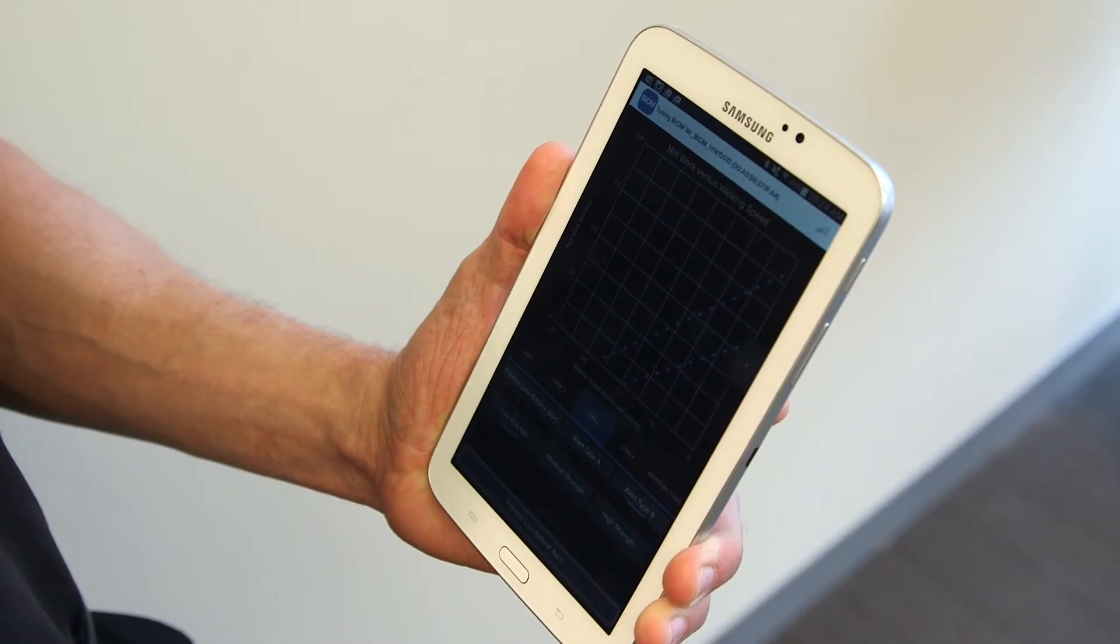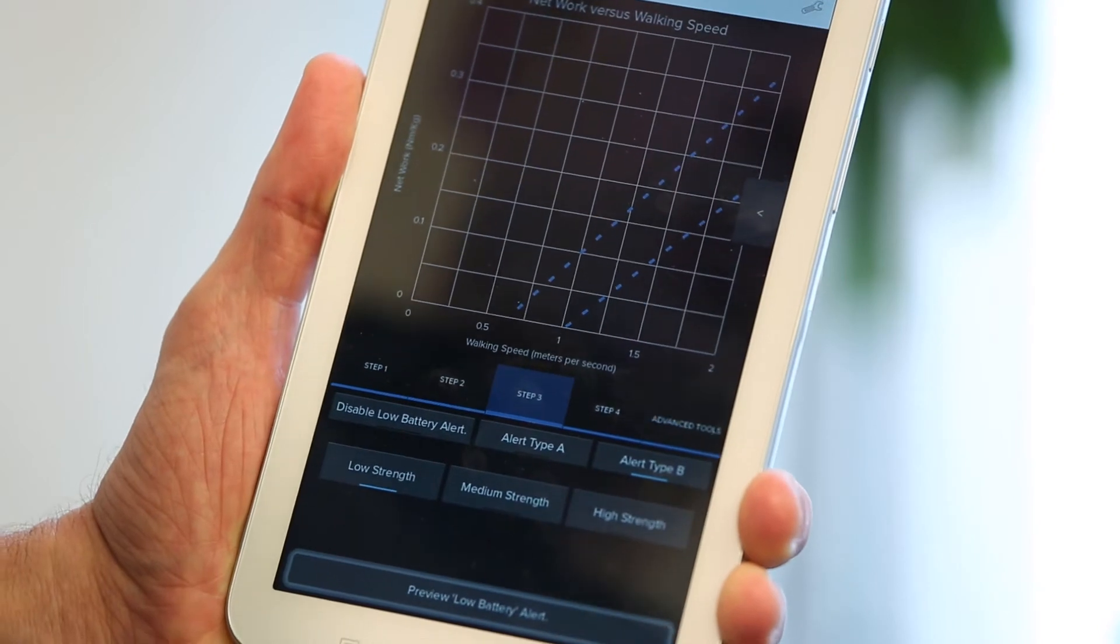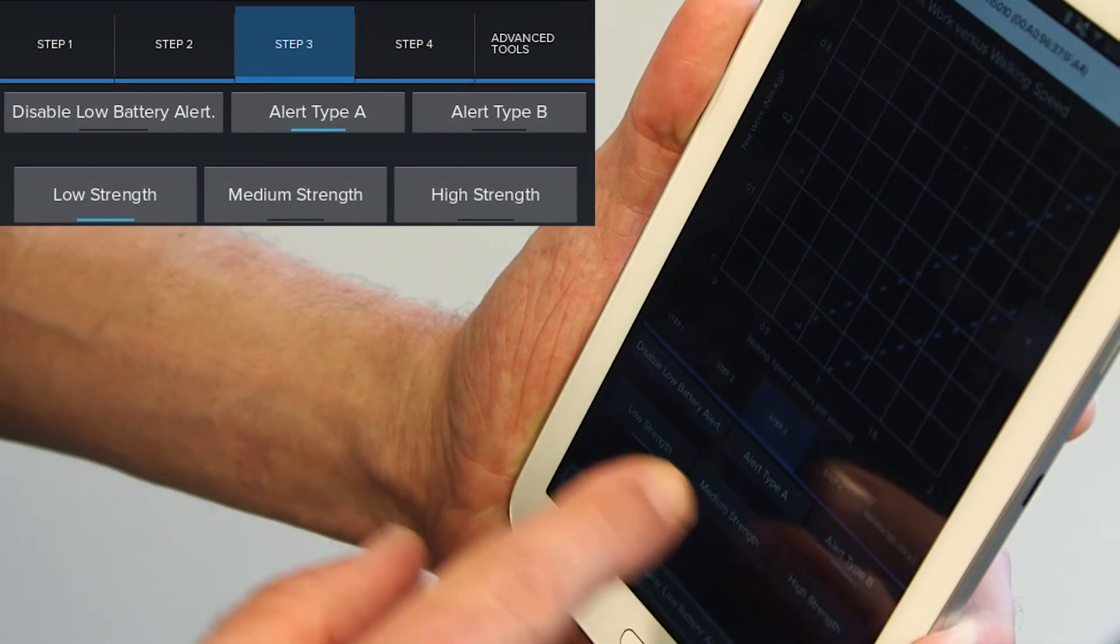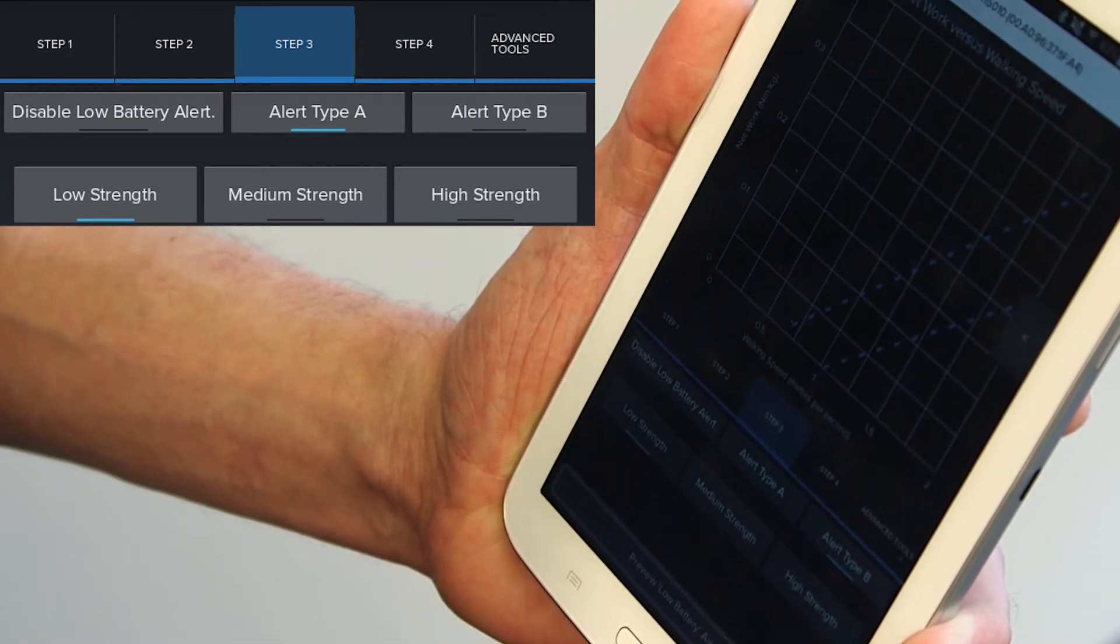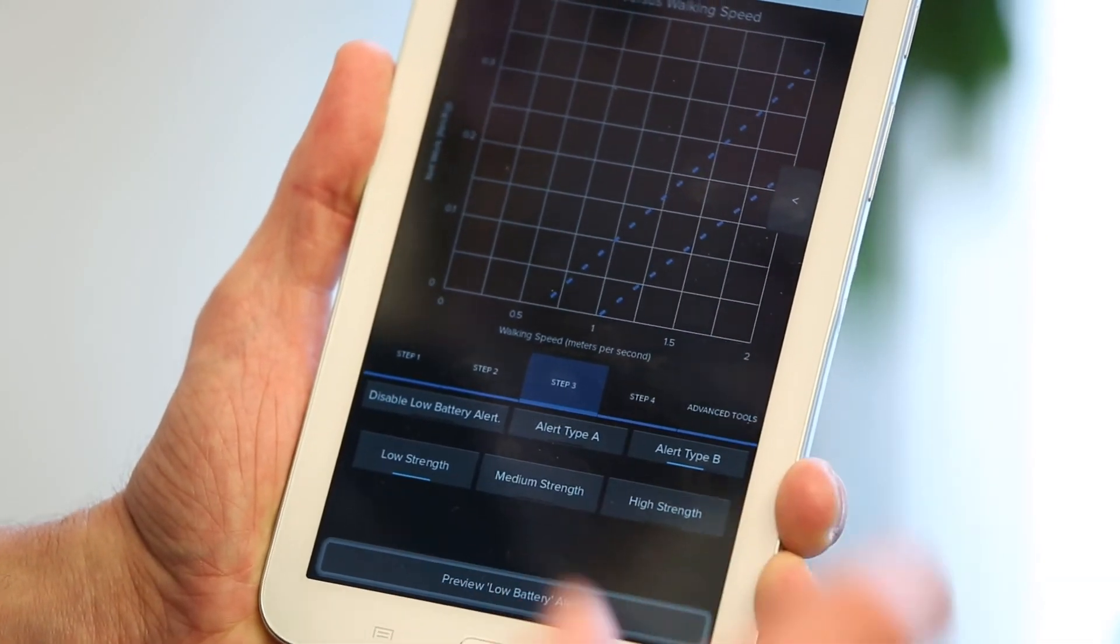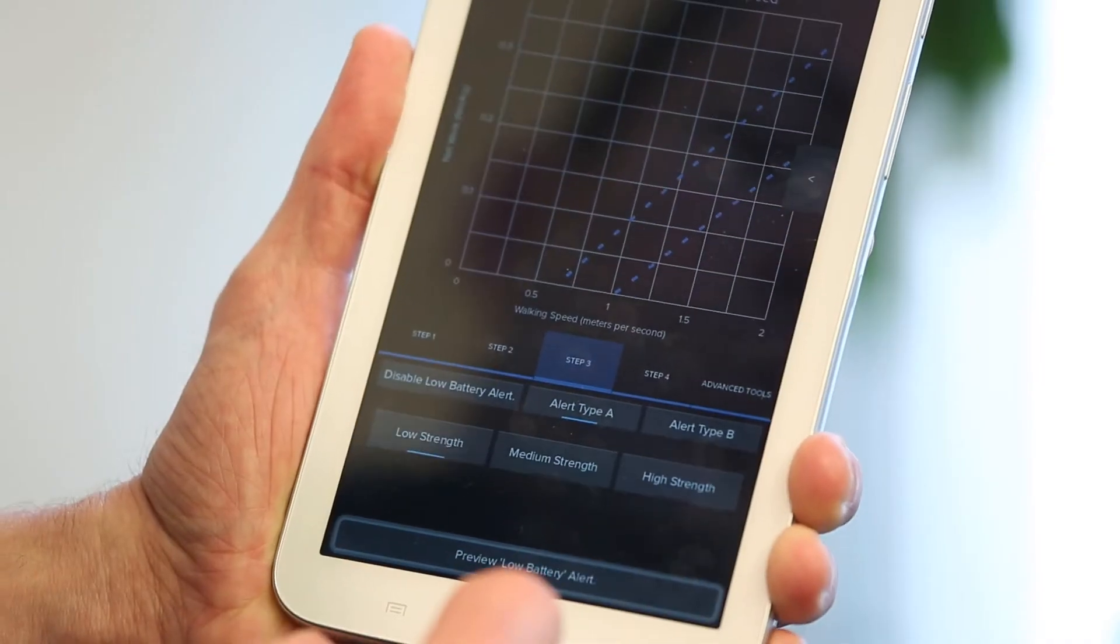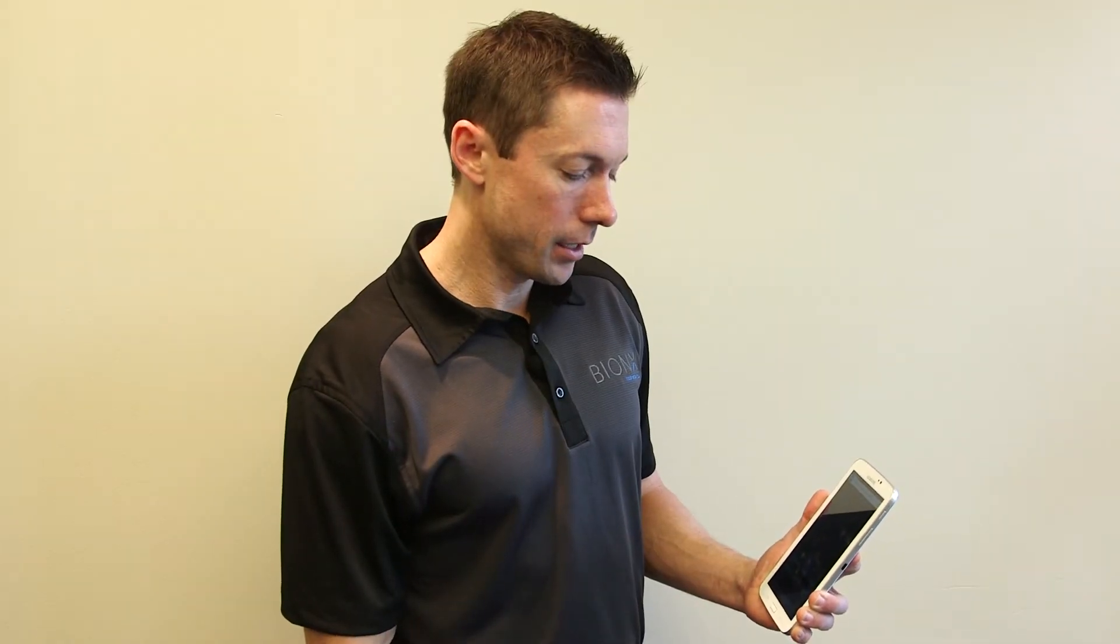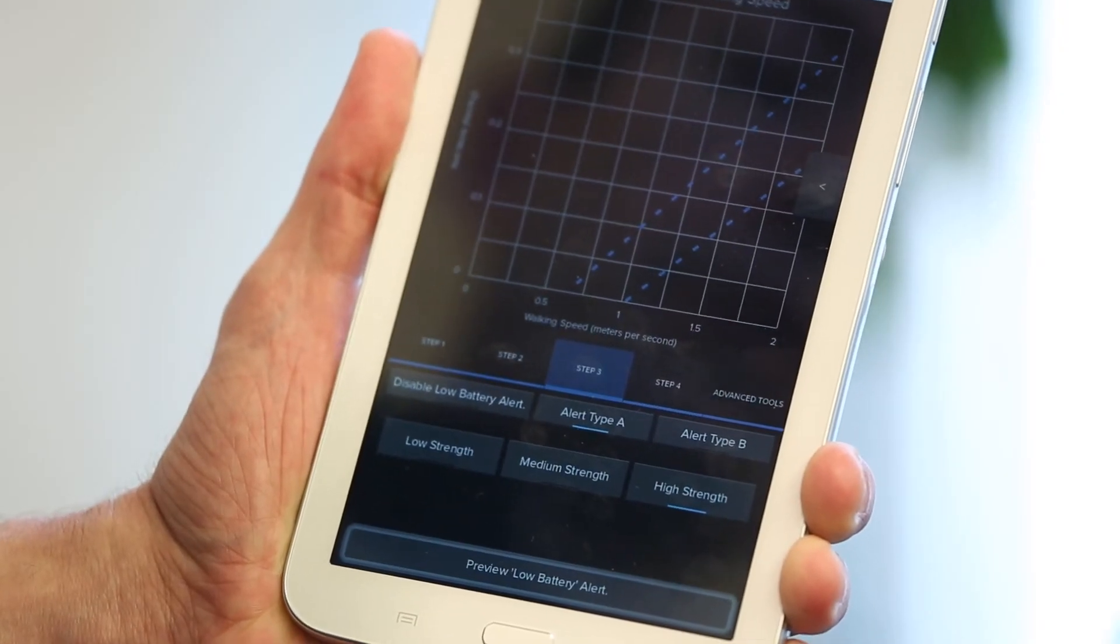Step three is simply setting the low battery alert for the patient. They will get a warning, which will be represented by the ankle vibrating. They get one warning at 20% and another around 10%. Step three is just giving you the option of what type of vibration they get. You can see here you have alert type A, alert type B, and then low, medium, and high strength. Type A and type B is the type of frequency, whether it's a fast or slow frequency. The strength is literally just how aggressively the ankle vibrates. You do have the capability to test low battery alert. You can choose, for example, type A, high strength, hit preview low battery, and this will cause the patient's ankle to vibrate. You can get feedback from the patient at this point if they can feel the vibration to confirm that they'll know when the battery is low.